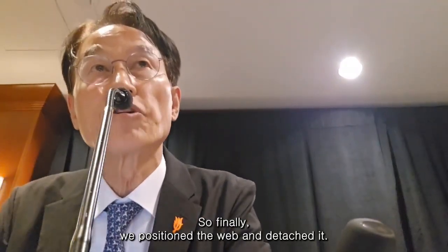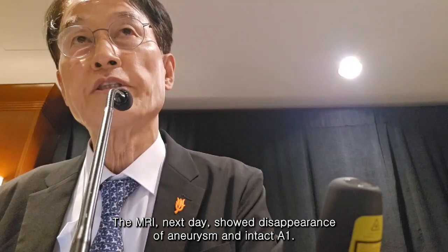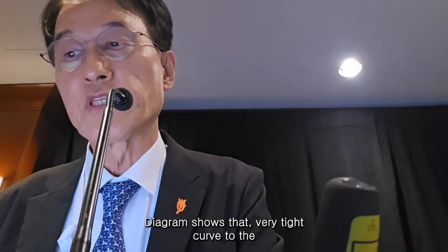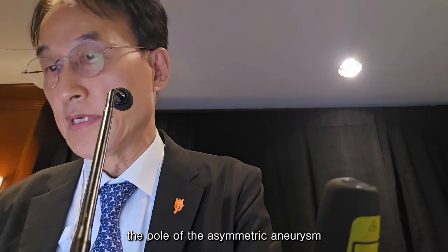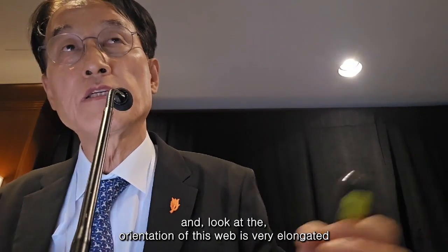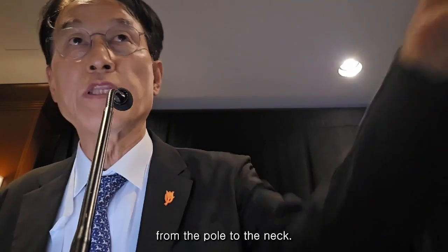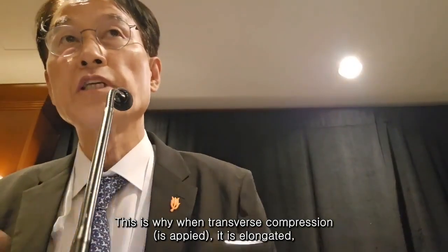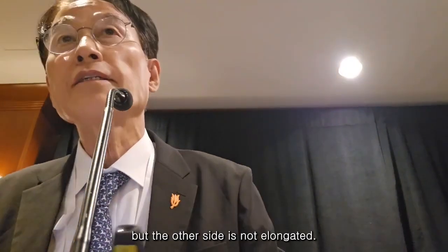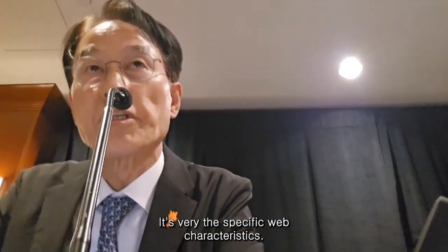So finally we positioned the web and detached it. This is the dyna CT. The MRI the next day showed the disappearance of the aneurysm, and the parent artery was intact. The diagram shows the very tight curve into the pole of the asymmetric aneurysm, and then we introduce the web and push it a little. Look at the orientation of this web: it is very elongated from the pole to the neck. That's why, with transverse compression, it elongated, but the other transverse side is not elongated.